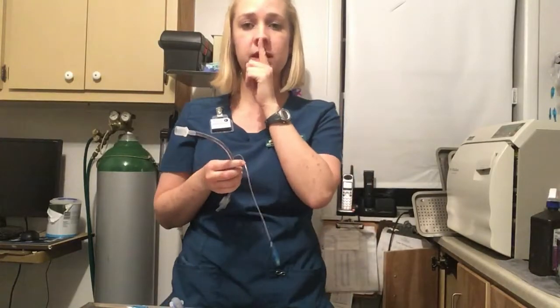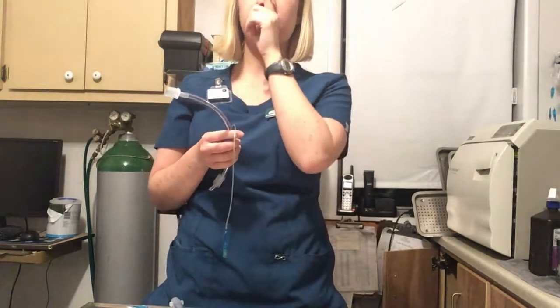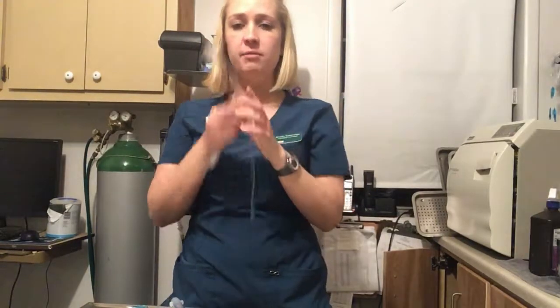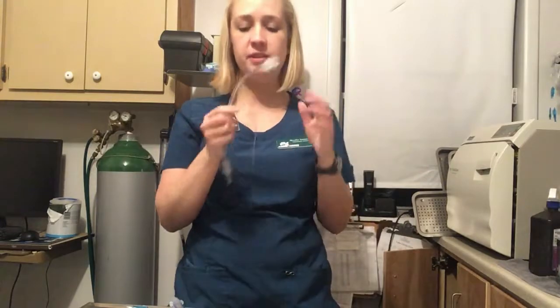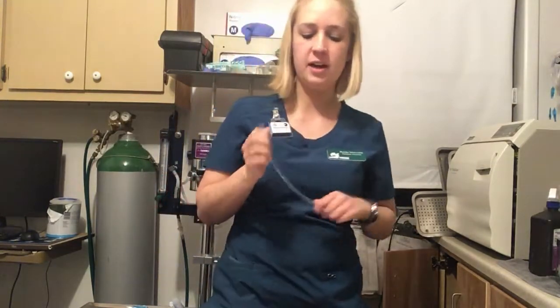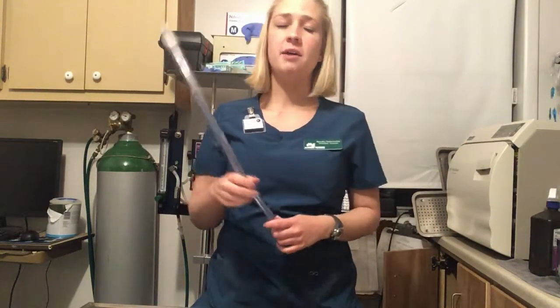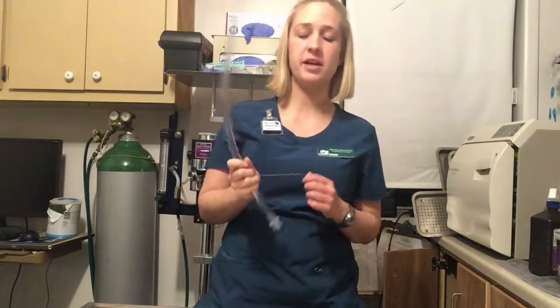Put it up to their nose, to the piece of tissue, the septum, right in the middle. You'll measure it up to that and see if it's about the same width, and you'll probably get an indication that it's the correct size. For your larger patients, you want to make sure that it is long enough, but you don't want it too long, where you start to get to the branches of the bronchi.